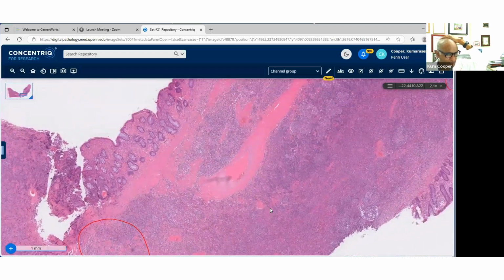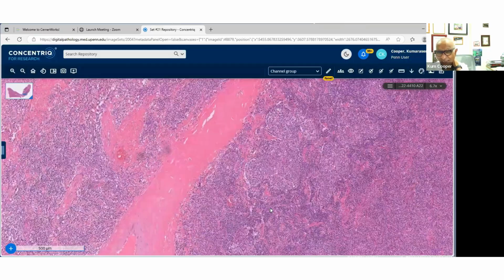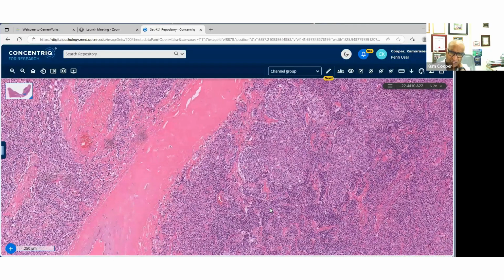Now, before you say, what's that? It's a variant that was described a long, long time ago by John Chan. He's from Hong Kong. He's that famous surgical pathologist with the hematopathology caps as well, but he's excellent in a wide variety of things. John described that variant in the liver and spleen many, many years ago. And they look just inflamed like this. And you remember in the old days, we used to call them inflammatory pseudotumors. But these focal EBV positive dendritic cells were highlighted with the Epstein-Barr virus.